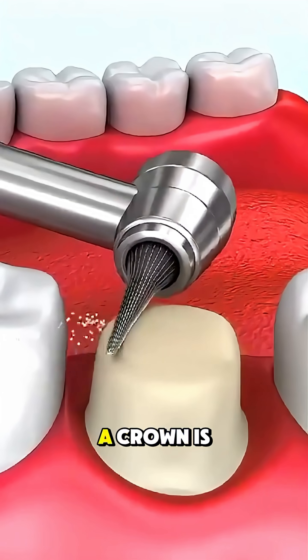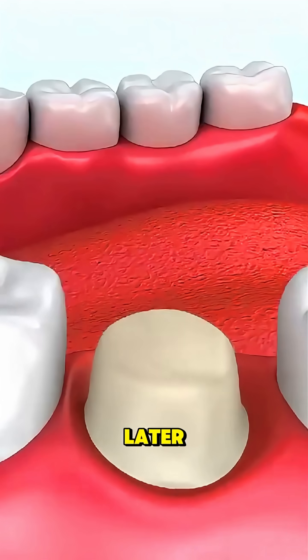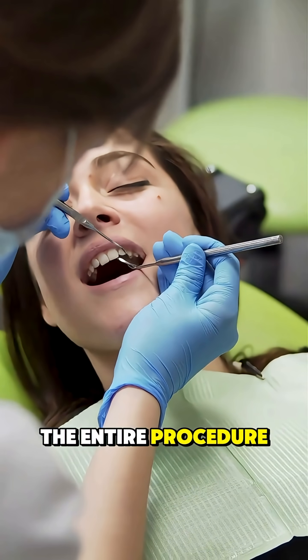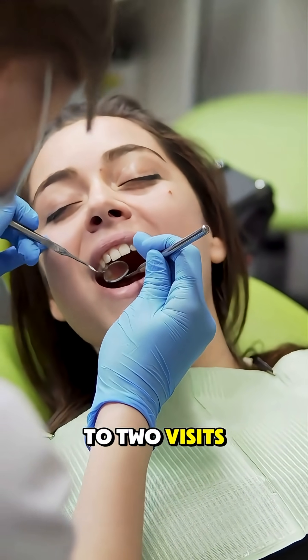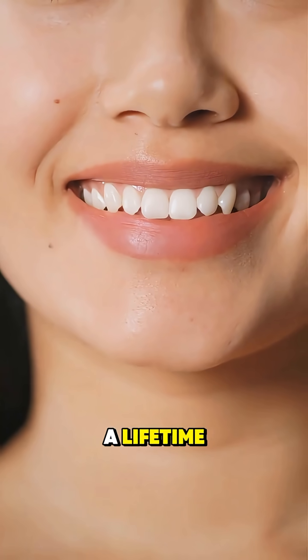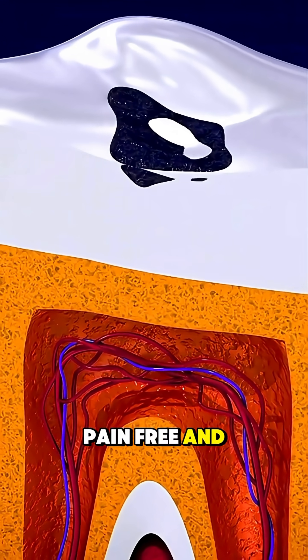In most cases, a crown is placed on top of the tooth later to protect it and restore its full strength. The entire procedure usually takes one to two visits, and with proper care, a tooth treated with a root canal can last a lifetime, pain-free and fully functional.